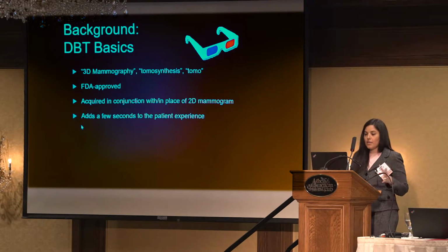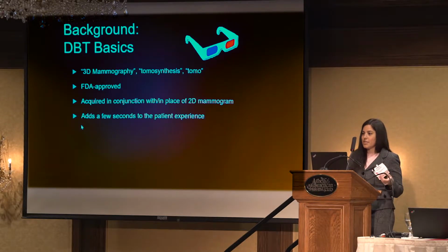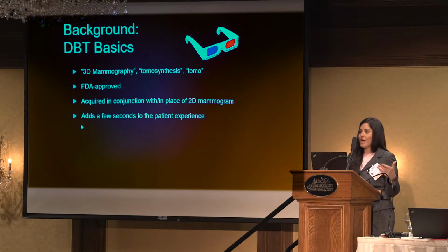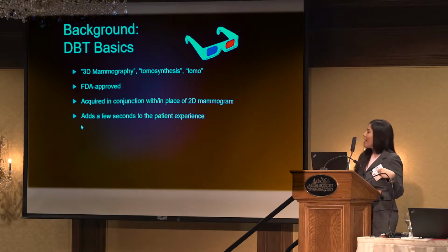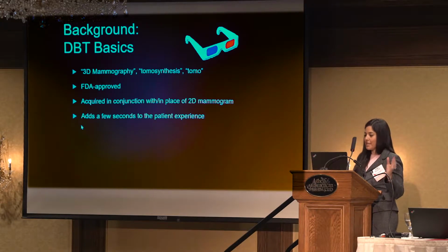So that's me. Throughout the talk, I'm going to refer to digital breast tomosynthesis as DBT, tomo, tomosynthesis, 3D mammography, 3D, just kind of whatever comes out. That's all the same thing. Contrary to popular belief, it's not truly a 3D image. I have had people ask me if I have to wear special glasses to interpret the study. I'm not kidding. Thankfully, these people were not my radiology colleagues. But it's not a CT, so it's not a true 3-dimensional image. We'll get into that in just a minute.